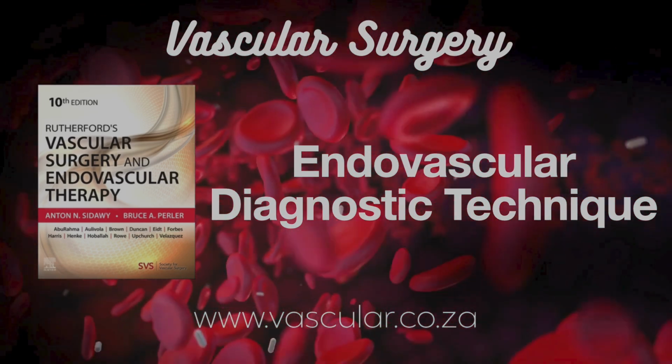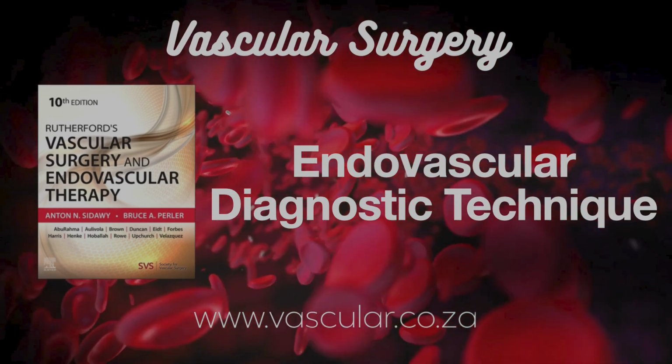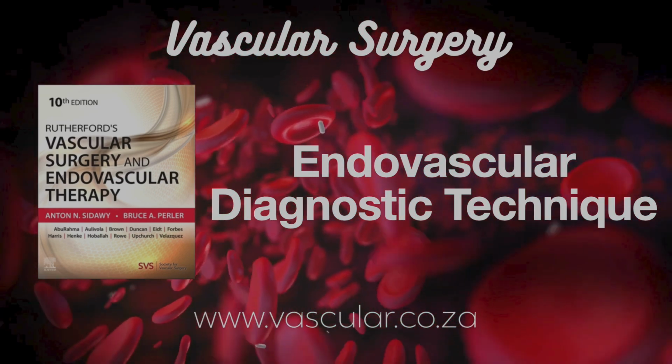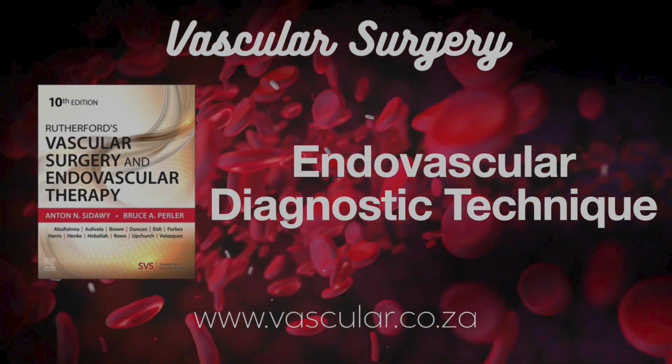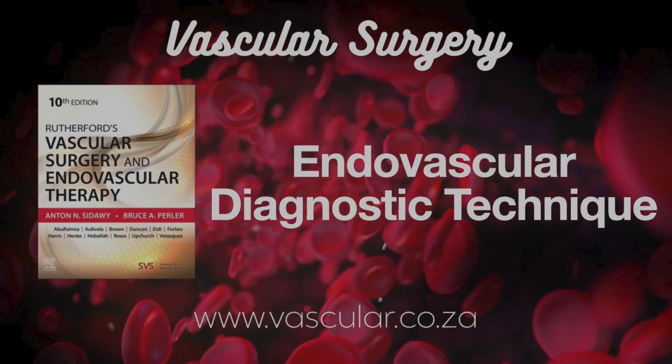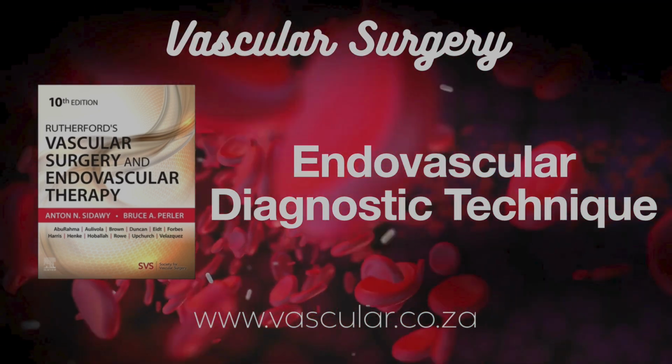Are there limitations? Size? Vessel condition. Definitely. AngioSeal, for instance, needs a certain artery size, no heavy calcification, usually up to 8 French holes. MINX usually up to 6 French. ProGlide typically up to 6 French too, though sometimes multiple are used off-label for bigger holes, like in percutaneous EVAR.